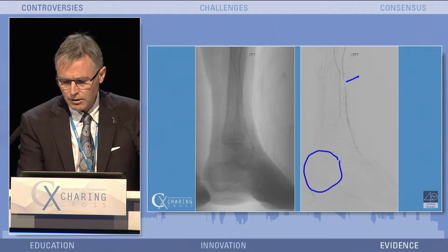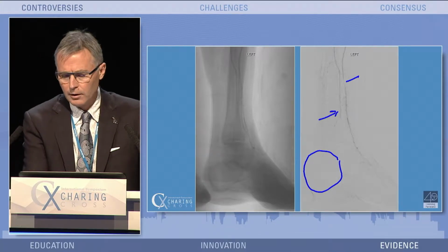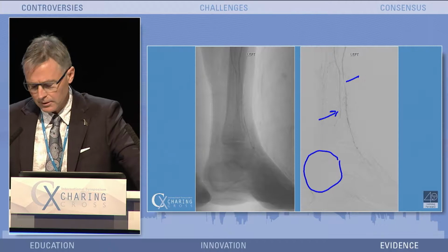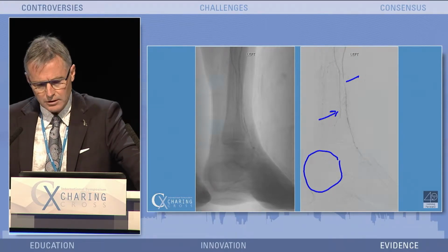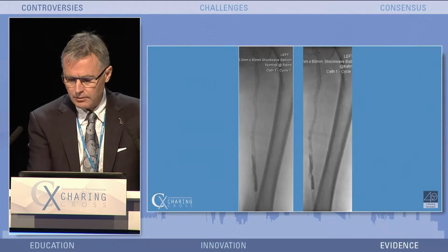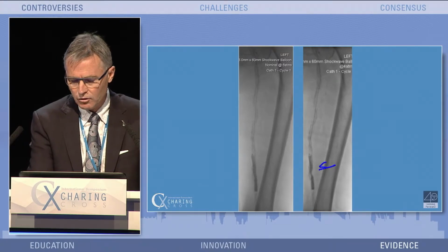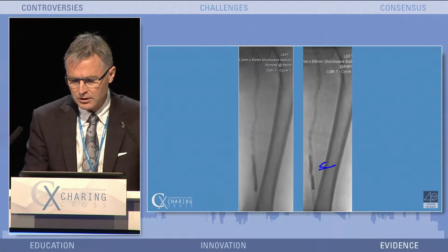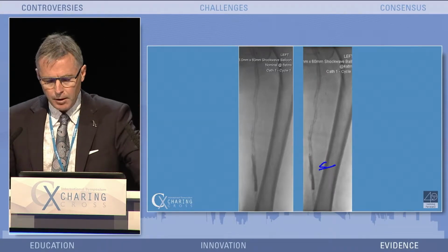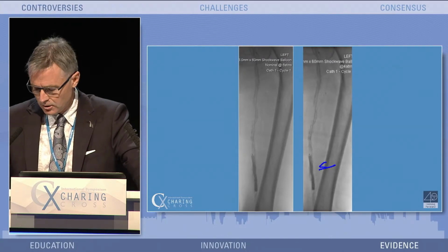Now, admittedly, there's not great perfusion to the heel, but we felt that we should target the tibio-peroneal trunk to improve that peroneal flow and also perform anterior tibial artery intravascular lithotripsy. This is what you've seen already, and this balloon kept at 4 atmospheres, slowly opening up as shockwave is being performed, as lithotripsy is being performed. Look at that balloon, no pressure change, the balloon opening up, popping out. You just can't do that unless you're getting a compliance change in the balloon.